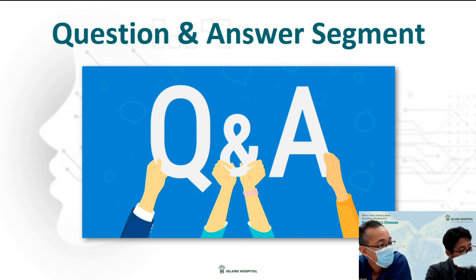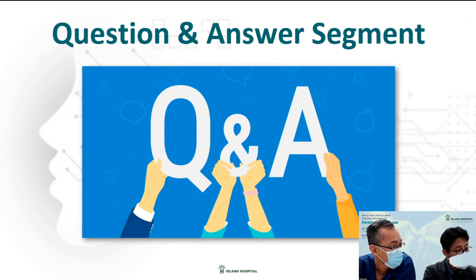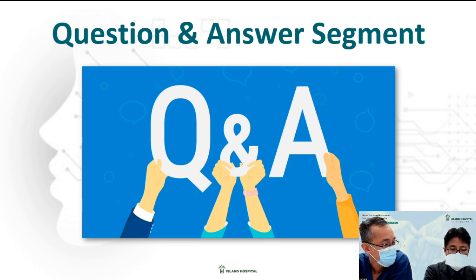Right. A very good question from Robert. The question is, does one need to display bilateral motor symptoms before deep brain stimulation? And the answer is no. You do not have to display bilateral symptoms. Although the majority of the time when you require surgery, you would have bilateral symptoms, and normally one side would be worse than the other. But you can have very bad resting tremors on one side without tremors on the other side, and almost normal symptoms on the other side, and you could still benefit from DBS.